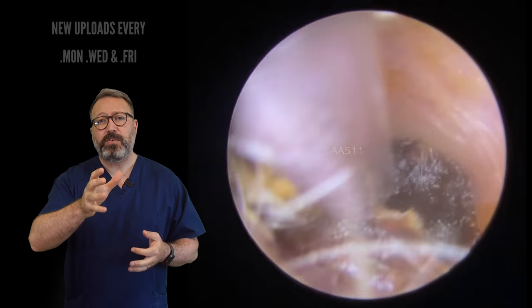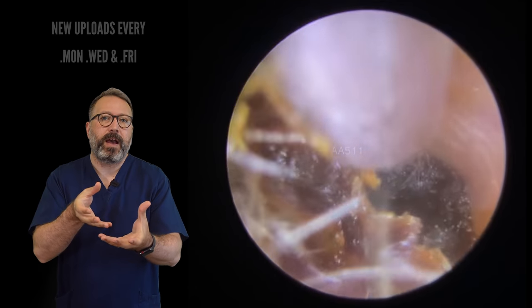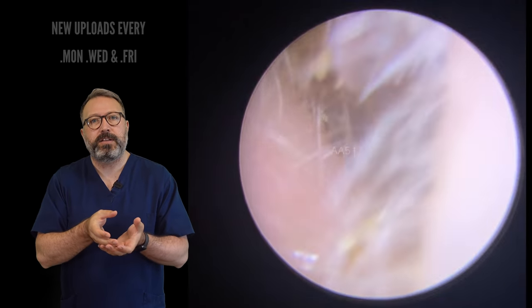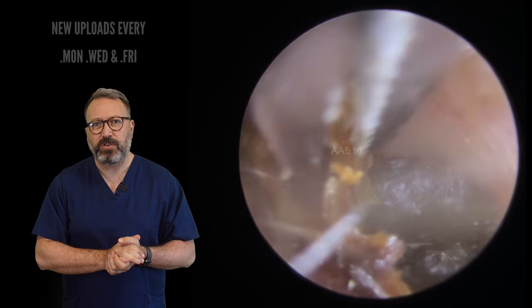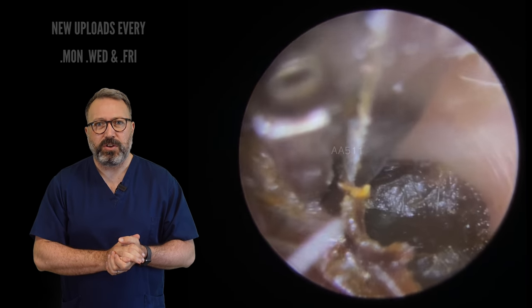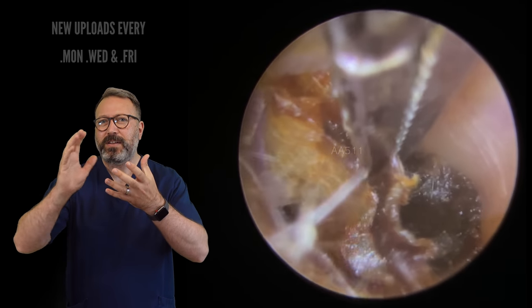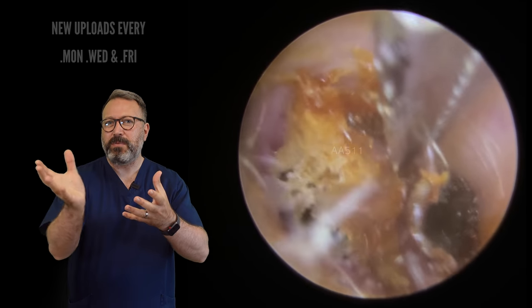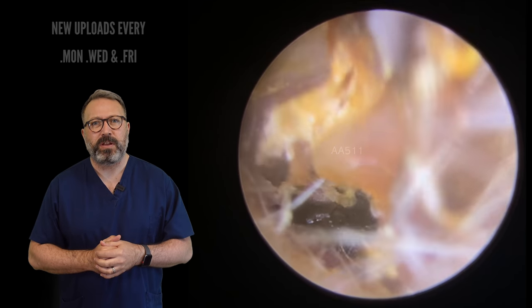What you can see me doing first of all is just removing this thin layer of wax that's come off this main block at the back end here, just running along the side of the canal wall. So we've just managed to peel some of that away. We'll lift this away now using the Crocodile forceps, so we'll get a good grip on this and just start to peel this away. You can see that little bit of underlying dry skin there just coming away from the canal wall, how that peels away. But it is coming away really, really well.